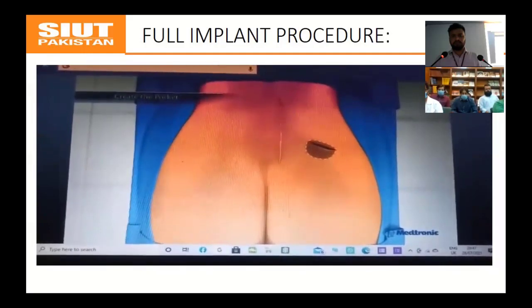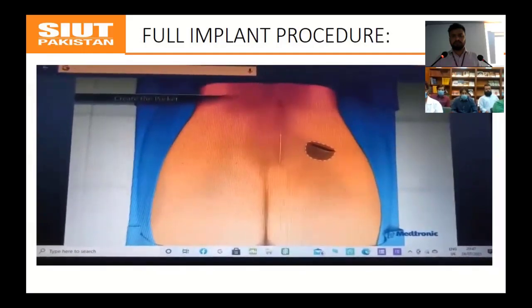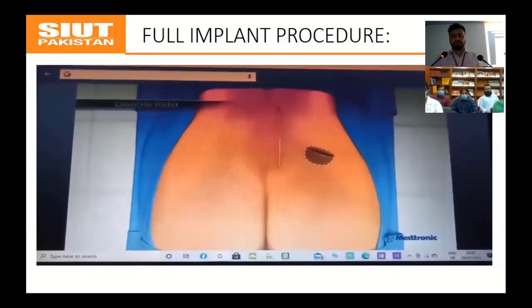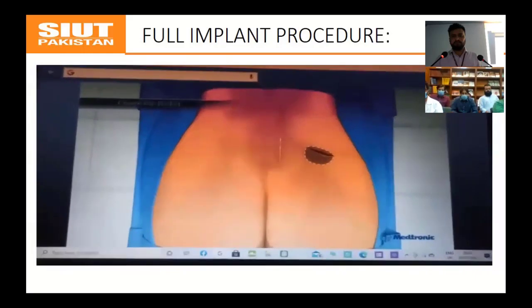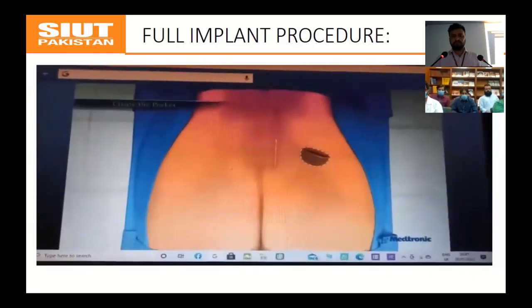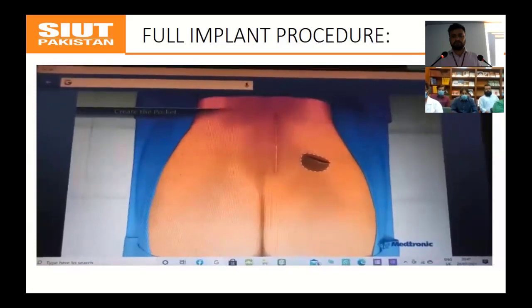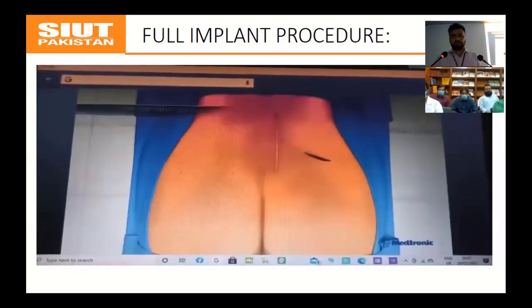It should be no deeper than 1 inch for the 3058 Interstim 2 INS to ensure proper telemetry with the physician programmer. To avoid infection, it is recommended that the neurostimulator implant site be irrigated with antibiotic solution in sterile water. Do not use saline.